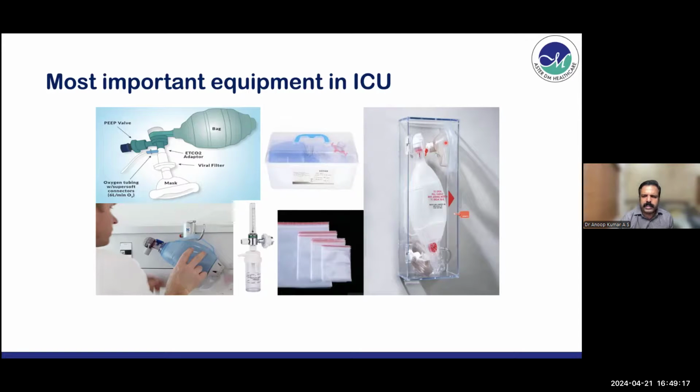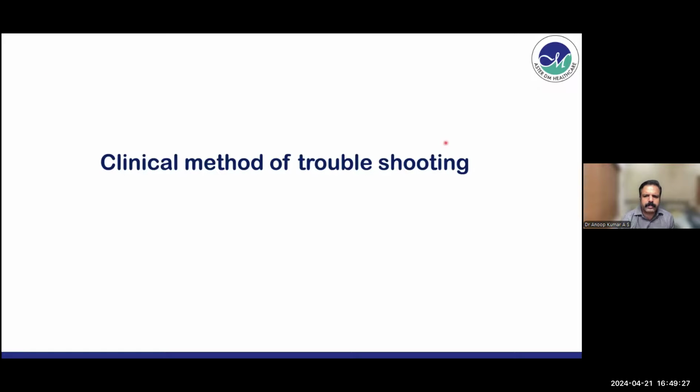What I'm trying to say is, whenever you are doing so, you may not have a proper ambu bag at the bedside. So make sure that all ventilated patients have a proper ambu bag.